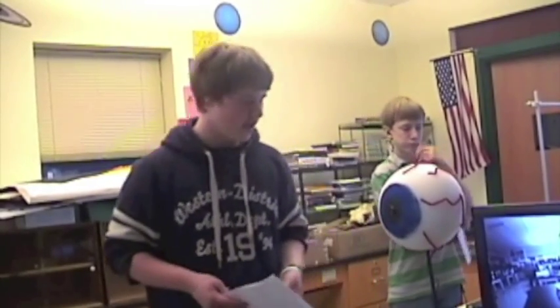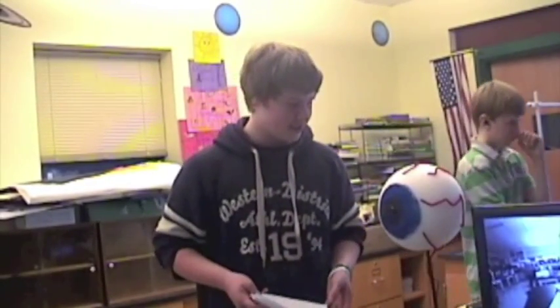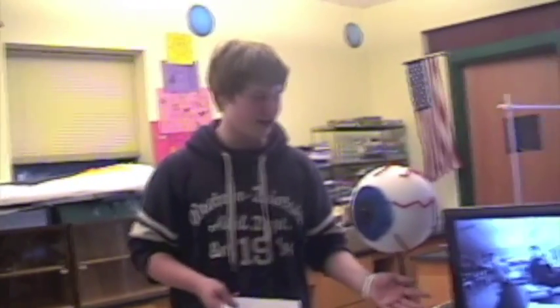And these glasses enhance your vision by increasing the amount of electrodes processed. So you can't see clearly, but you can see enough to move around objects. And eventually scientists hope to advance it enough to be able to see clearly in black and white like this.